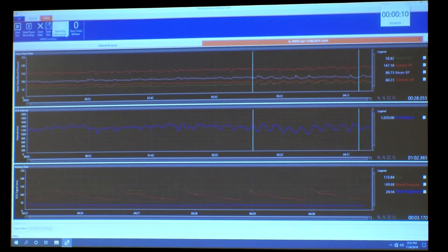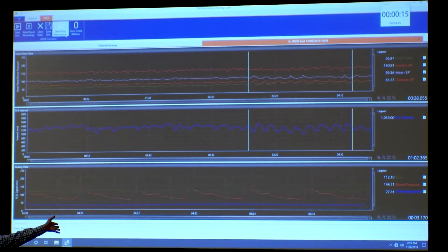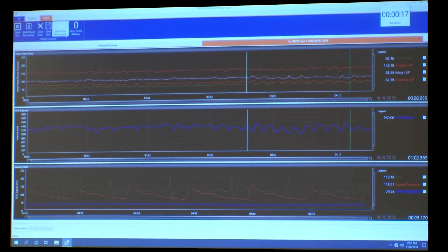You can see it automatically put that mark on the screen at the start and the stop. On the display, the middle graph is the R-to-R interval, which is just the inverse of the heart rate.